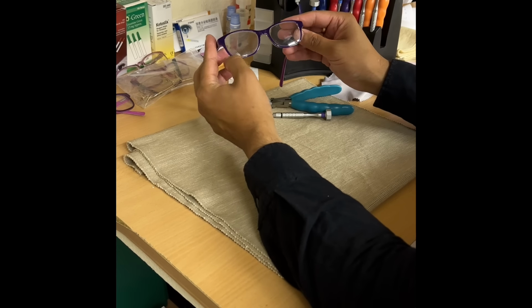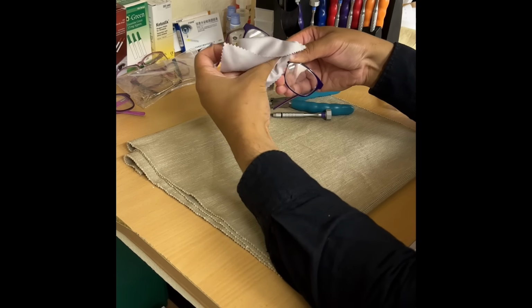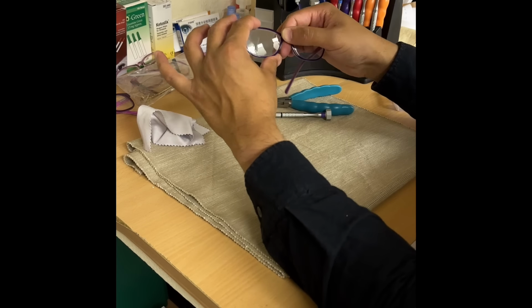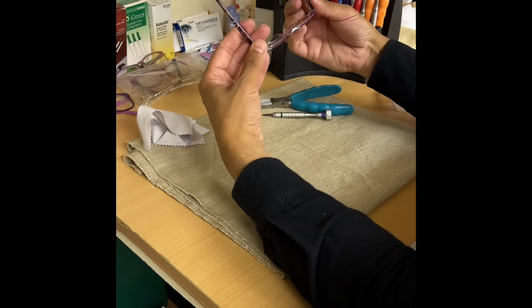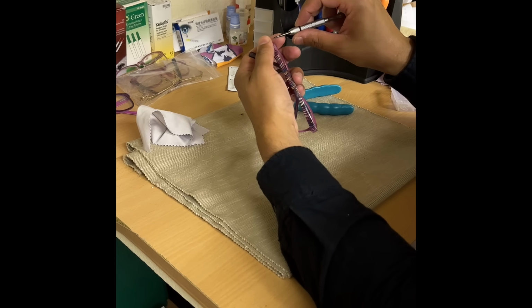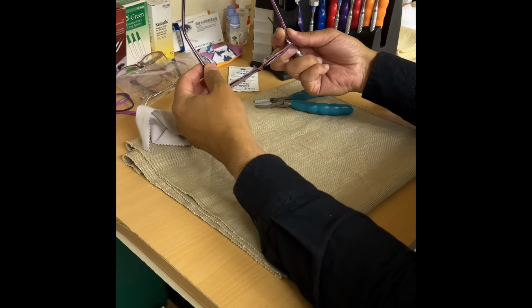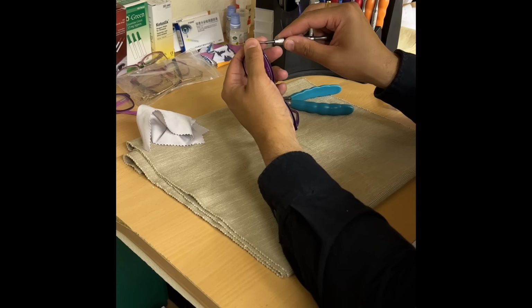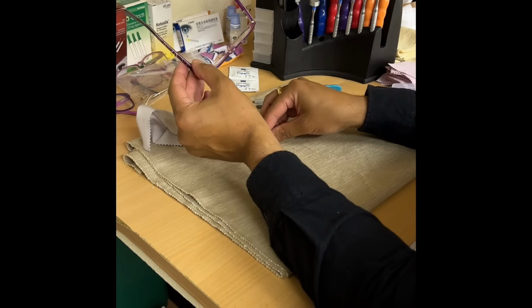Right, the plastic purple pair here, and again lens defects. Yep. A hairline scratch there and an abrasion here, as well as an abrasion there. So we'll replace those lenses too. Just tighten up the sides there. So the disparity there. They do slacken off in time, so you can always come back for an adjustment once over. Okay, leave that one with me.